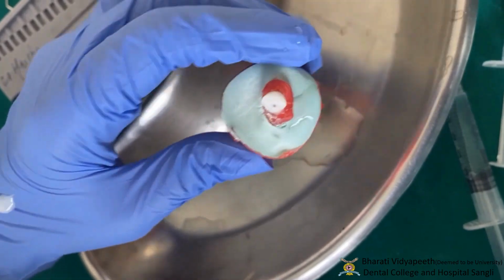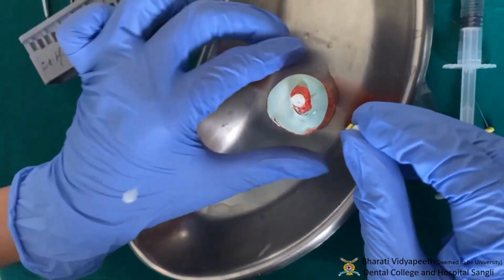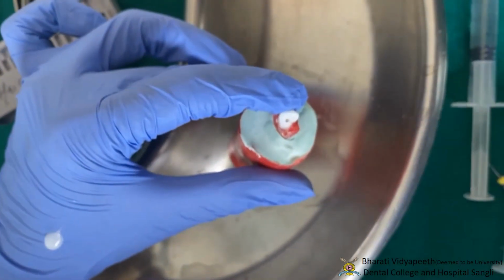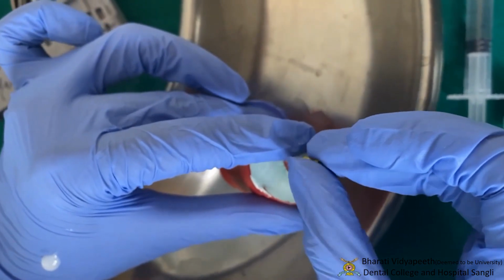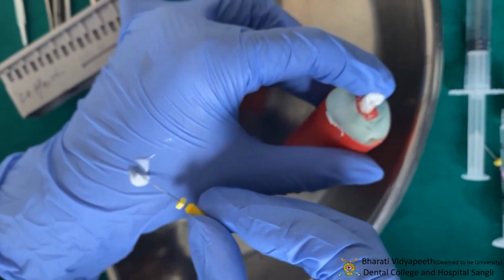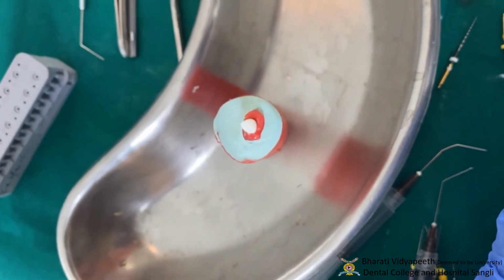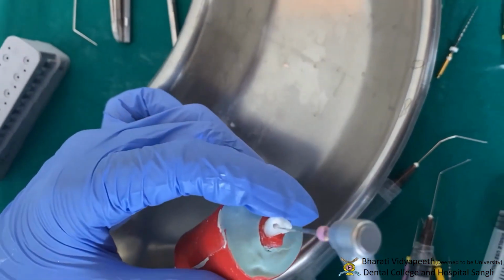The canal is prepared till a number 20 hand K file. After preparing with the number 10 K file up to the working length, a number 15 K file is inserted till the working length, followed by a number 20 K file. The filing is done with the help of EDTA gel, and irrigation is done after use of every instrument. An S1 file is inserted up to the working length in the canal. EDTA gel is used as a lubricant.